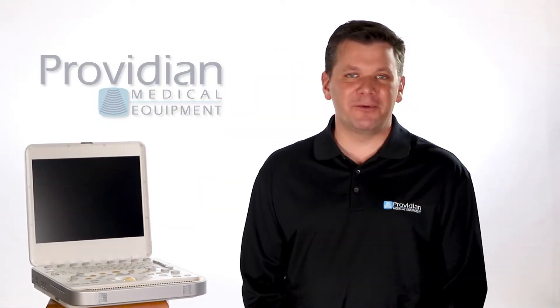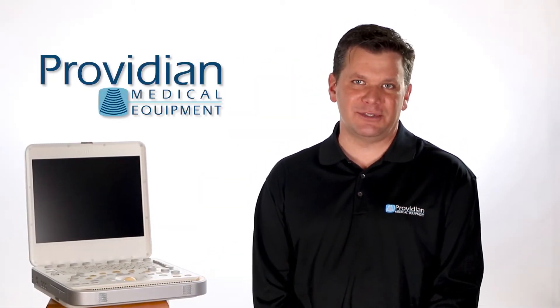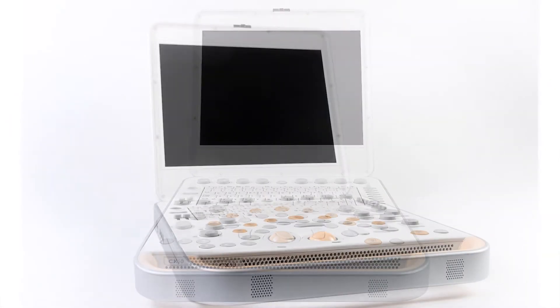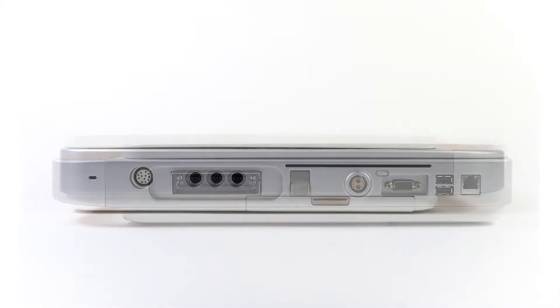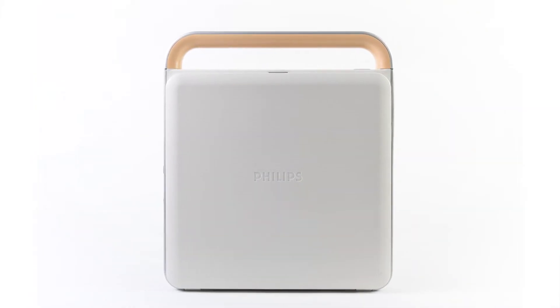Hi, I'm Brian Gill from Providian Medical and this is the Philips CX50 Portable Shared Service Ultrasound Machine. When it was released in 2008, the CX50 established itself as the premium cardiovascular ultrasound machine and it also came at the premium price. And even today that still remains true, except the landscape has changed.